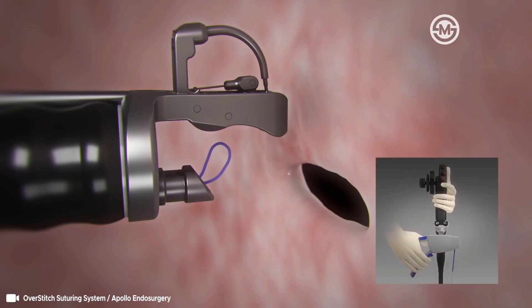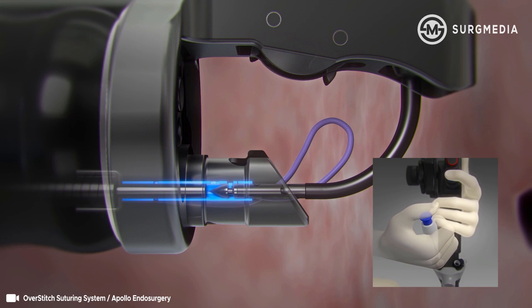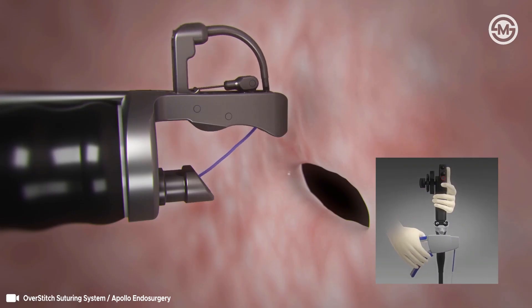Prepare to load the needle body by closing the needle driver handle. Advance the anchor exchange catheter until the anchor clicks onto the needle body and will not advance further. Press the blue button on the anchor exchange catheter and pull back approximately one centimeter to disengage from the anchor exchange catheter. Open the needle driver handle.